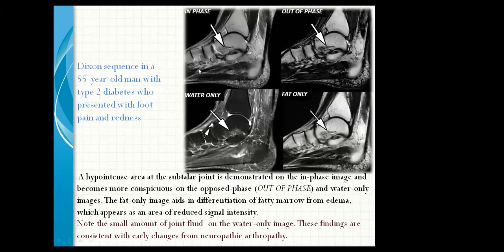This is a Dixon sequence in a 55-year-old man with type 2 diabetes presenting with foot pain and dryness. Hypointense areas at the subtalar region are demonstrated in the in-phase image and become more conspicuous in the out-of-phase and water-only images. The fat-only image is needed to differentiate fat from edema, which appears as an area of reduced signal intensity. Note the small amount of joint fluid on the water-only image; findings are consistent with early changes from neuroarthropathy.